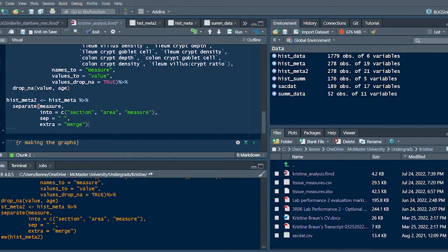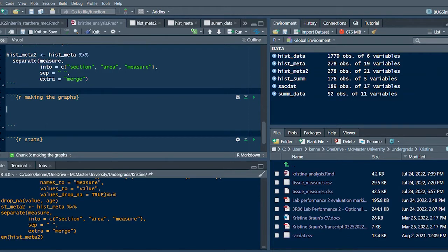Okay, so I think now we are ready to make a plot. We are going to use this data frame that we just made and assign this to the object P for plot. First off, the easiest way to make the plot is to select which things from our data frame we want first.